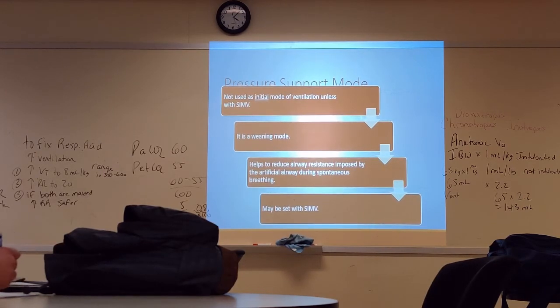So yes, PSV as a standalone mode, there is no set rate, cannot be used on people who are not spontaneously breathing, okay? Now, we love pressure support as part of other modes like SIMV because it can help overcome all of this awful mechanical dead space. You guys are not going to want to breathe through that circuit without some help. It's just too much effort, okay?